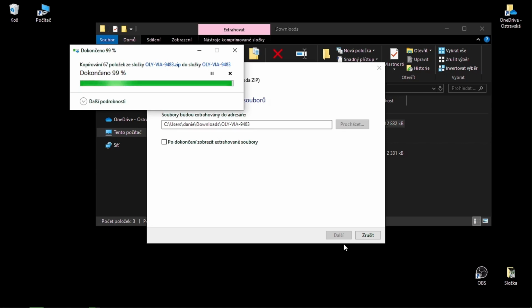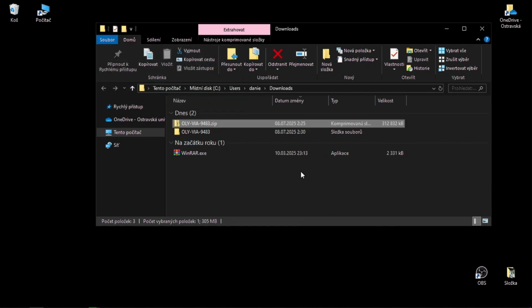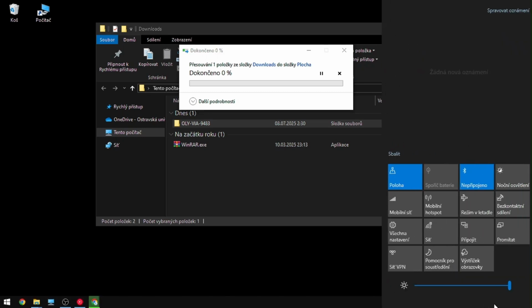There is also an alternative for viewing it on your mobile phone, which I will cover in the upcoming video, not in this one. And after you've extracted it, you can just delete the original file, and this is what you wanna go with.